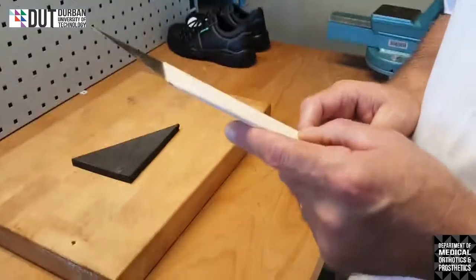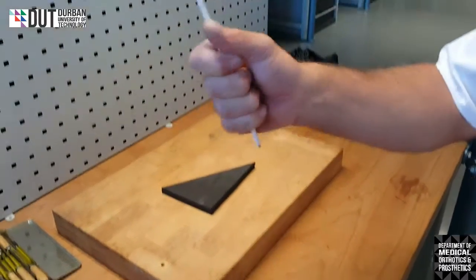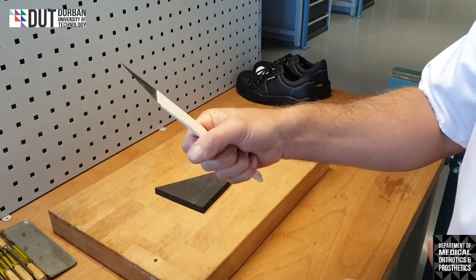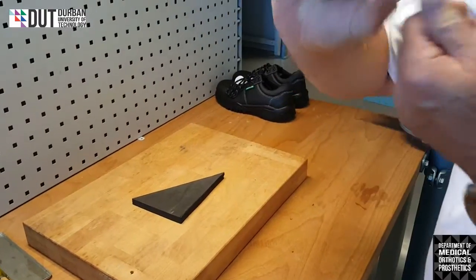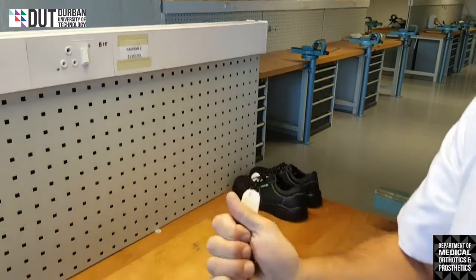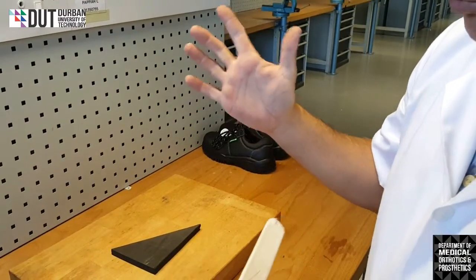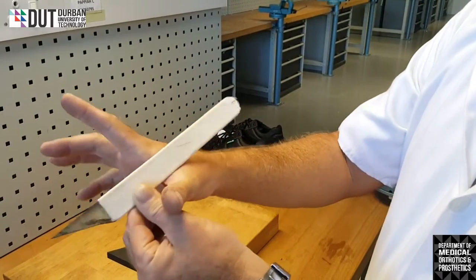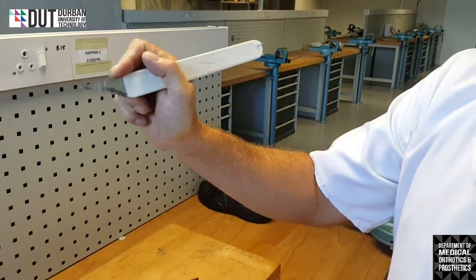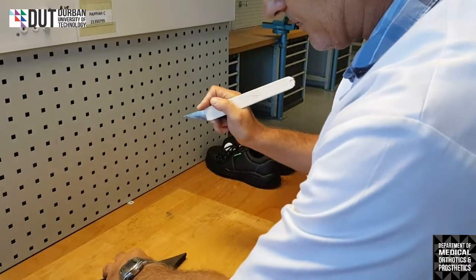What we need to do is look at a few points. Please do not grab and choke the knife like you're going to stab somebody. You can't cut that way. You cannot cut the opposite way either, like you're going to stab somebody over the top. It's impossible. The best way I find is to use it like a pen. If you were holding a pen, you would put it neatly into the palm of your hand, and use one finger over the top, and there you can actually cut with it.